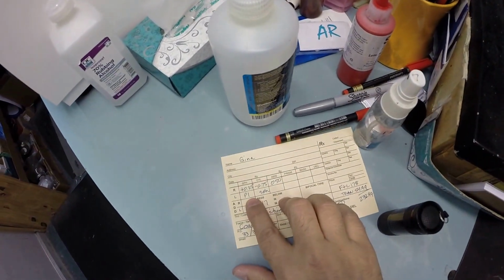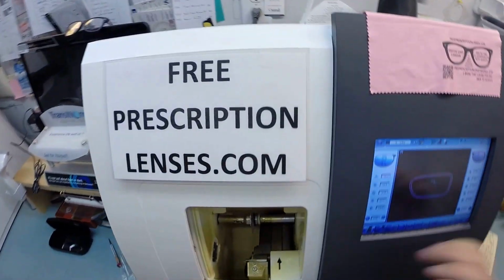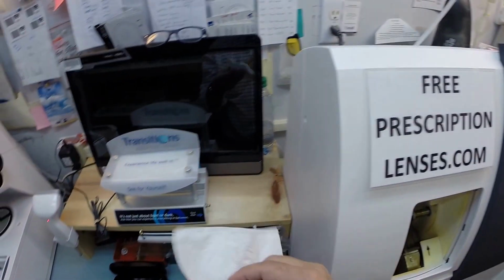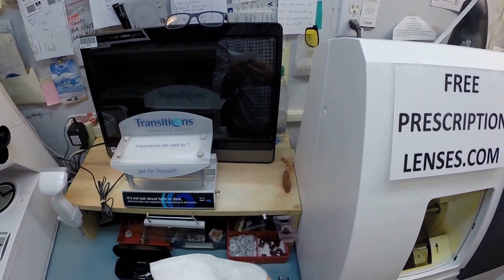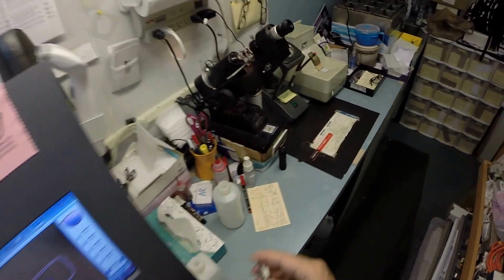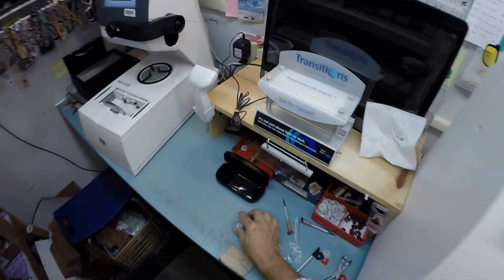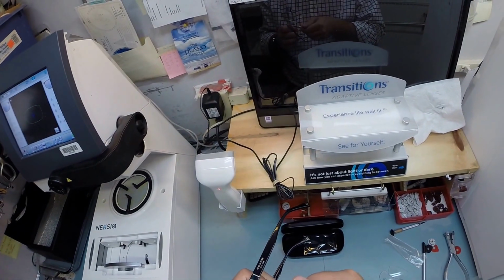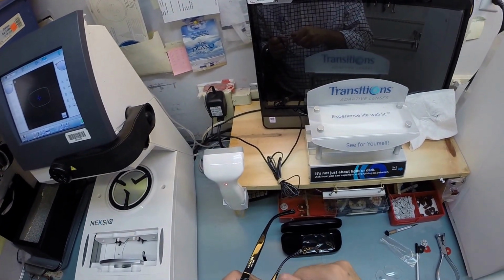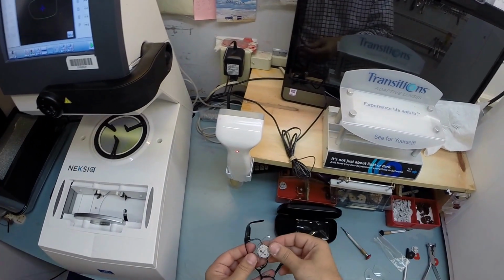Now your left eye needs actually no correction whatsoever. You're 20/20 in that eye, but we need to put another lens in there, especially because you have transition lenses. So let's dry everything off. I'm gonna run my thumbnail around to make sure everything is perfect. Let's come back down here. I'm gonna grab my screwdriver, do the old lefty loosey, and we're gonna tuck that lens in there.